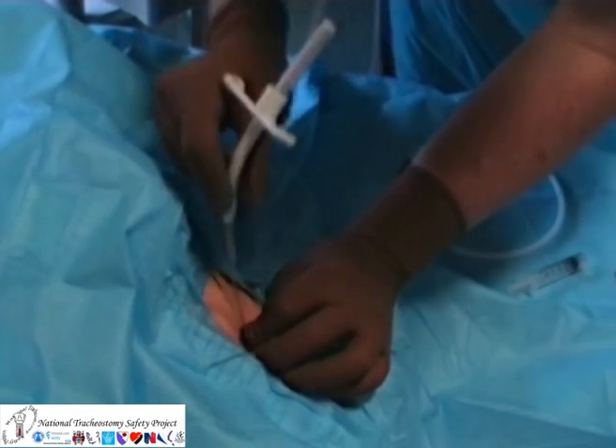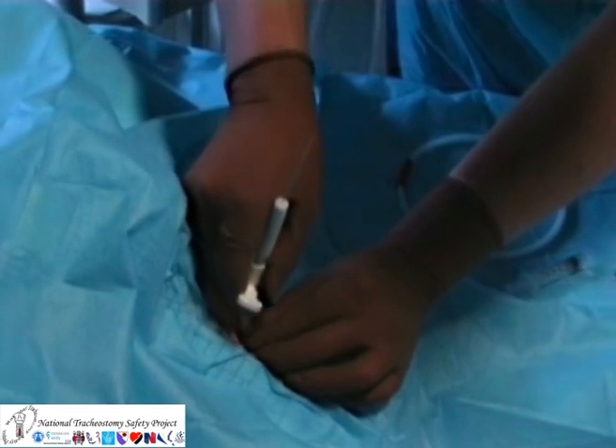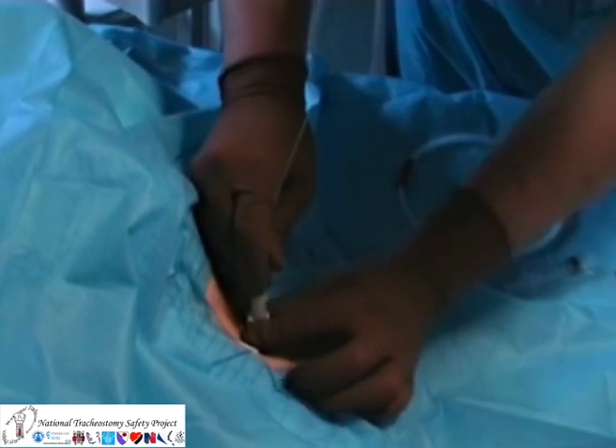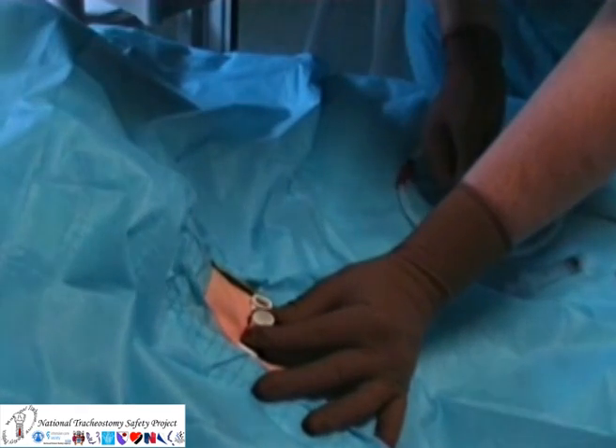The cannula is preloaded over a dilator and the whole assembly is inserted over the guide wire as shown. The wire and introducer can then be removed. Before the cannula is secured, I connect to an appropriate oxygen supply.